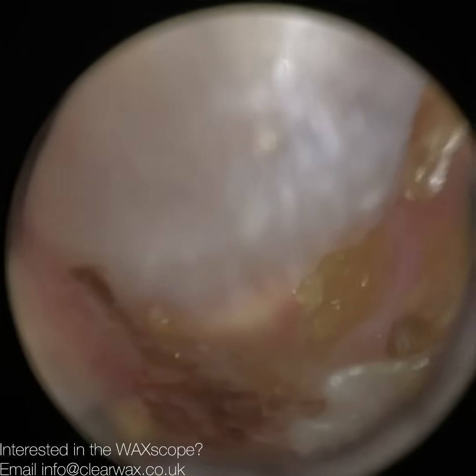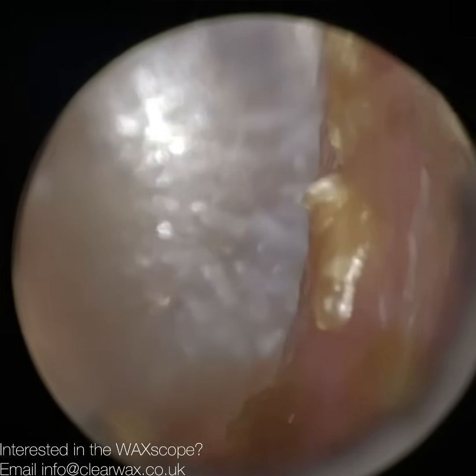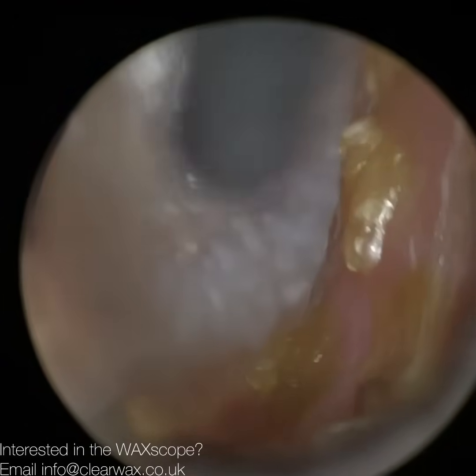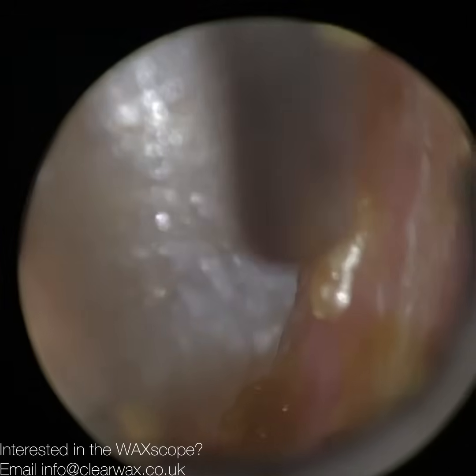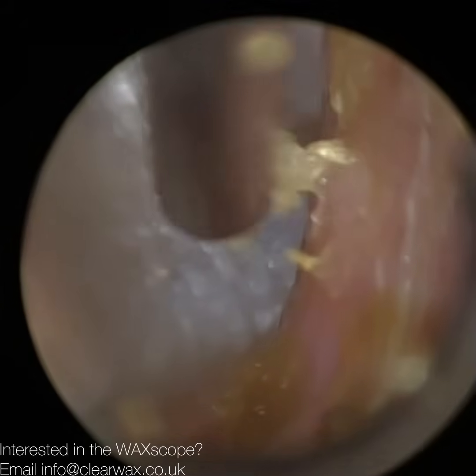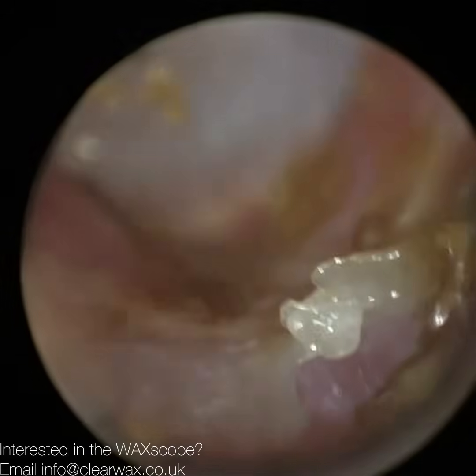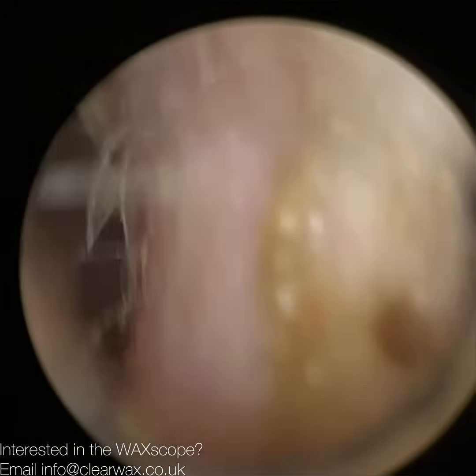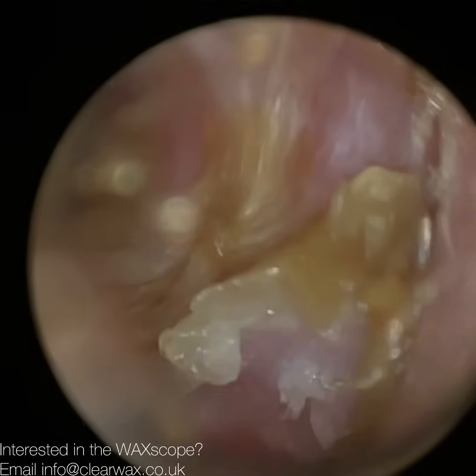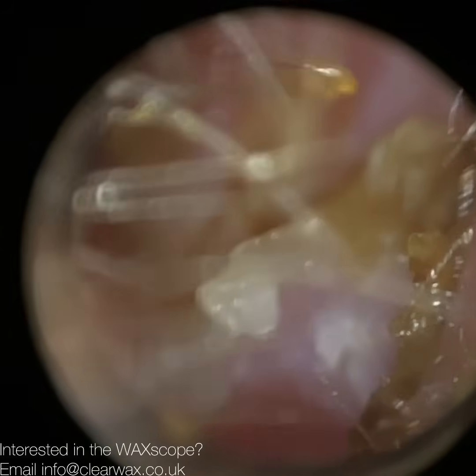In terms of treatment, this patient needs regular cleaning of their ears. Now they advised me that they used to have their ears irrigated every couple of years. Irrigation wouldn't remove that plug, so I'm hoping this patient obviously didn't have this condition when they last had their ears irrigated, because it would be an inappropriate method of removing this. And indeed, they may have not removed it, and hence why this blockage is quite severe.